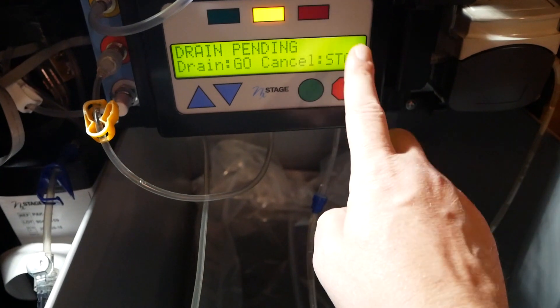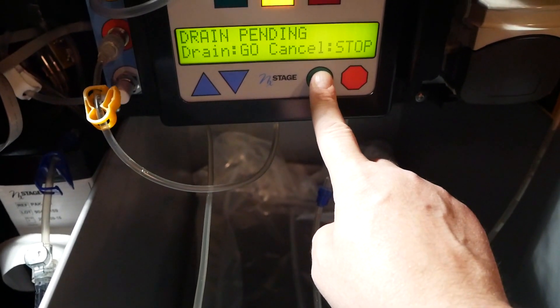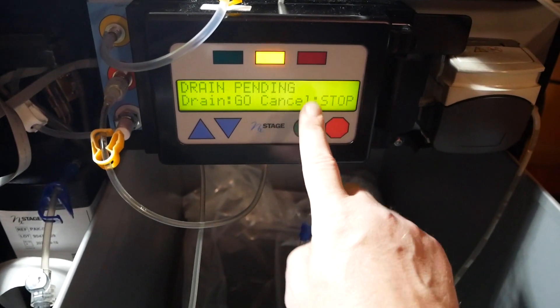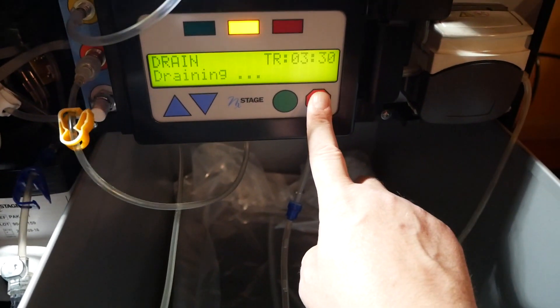It says 'stop go cancel stop go' - it's trying to trick us rabbit-season duck-season style into pressing a different button. We're not falling for it - we're going to hit the green button and tell it to go. Now it starts the draining process, but it's empty so it drains dry.